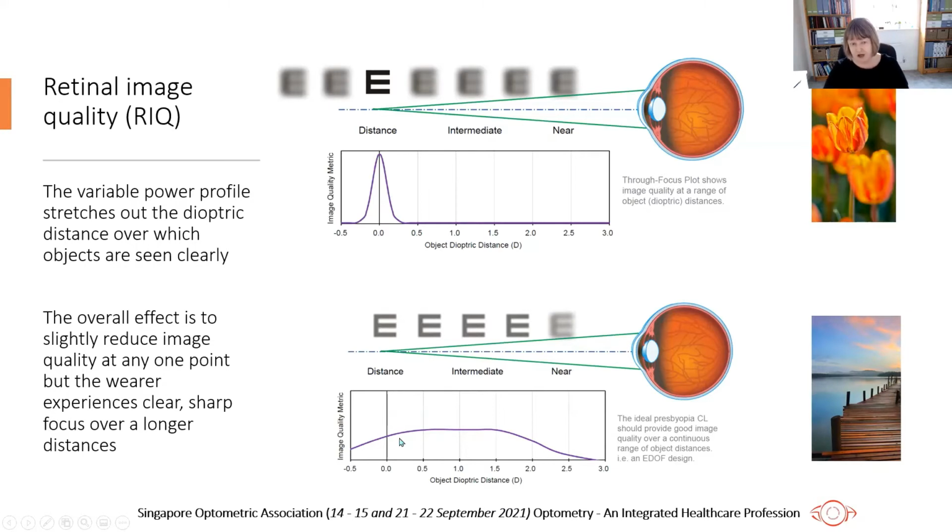If we stretch out that packet of light to give you an extended depth of field over a longer distance, you are actually spreading the same energy out over a longer distance. And although that in effect reduces the clarity of the objects over that distance, your eye doesn't perceive that. It just perceives everything as being equally clear, as in on this boardwalk.